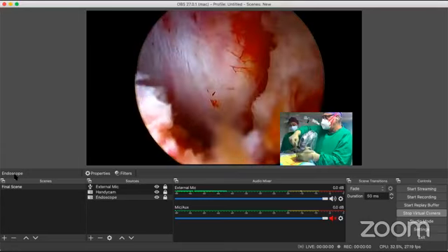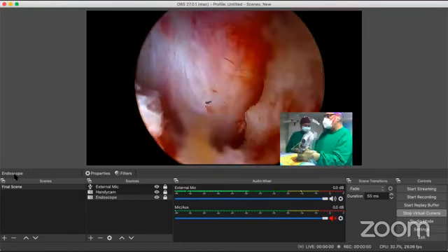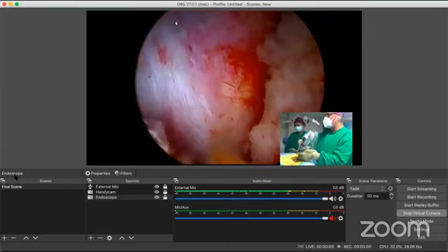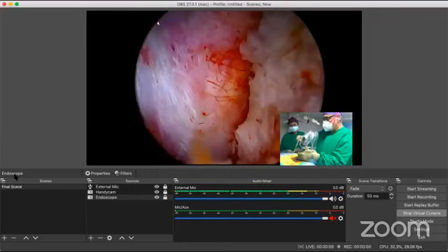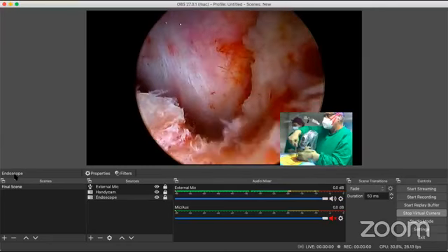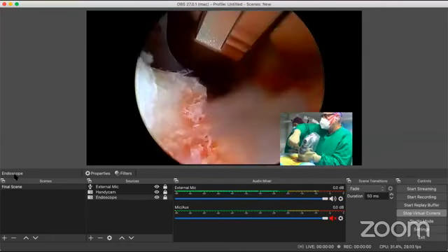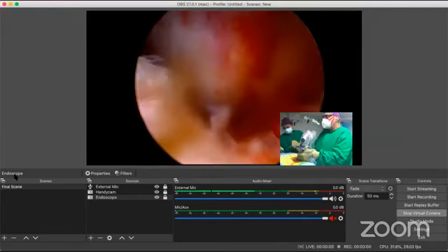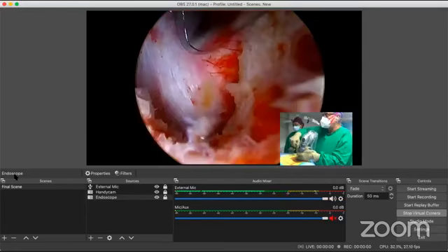And you can see how the root is becoming free as it is pulsating now, and it is becoming vascular. You can see a vascular flush coming into the root. Okay, but at the same time, we have not opened up its membrane. We have not disturbed it. Everything we're trying to do, without disturbing the nerve root. And we are going sufficiently lateral.